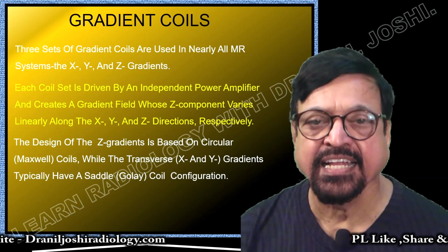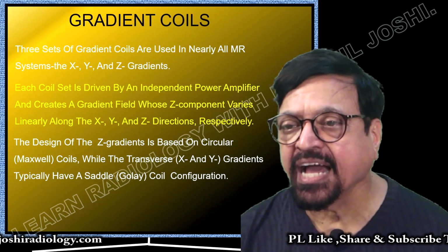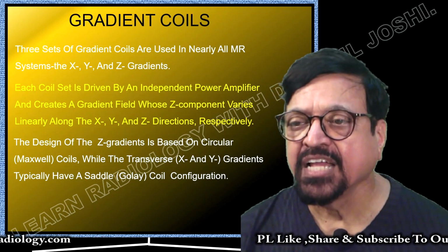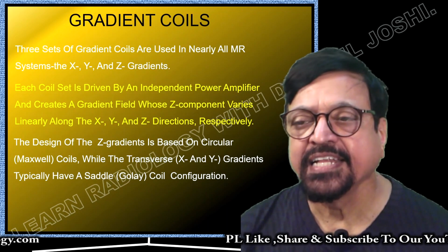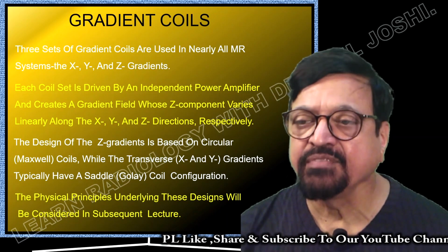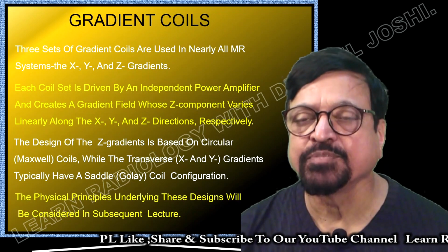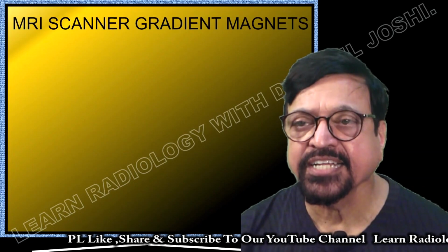These are the names given to them, while the transverse X and Y gradients are typically saddle, that is Golay coils. These are names given to them according to their configuration. The physical principles underlying these designs will be considered in subsequent lectures or in earlier lectures.